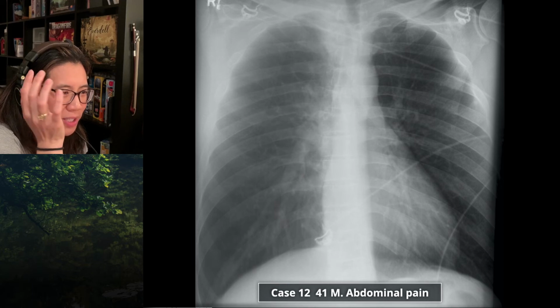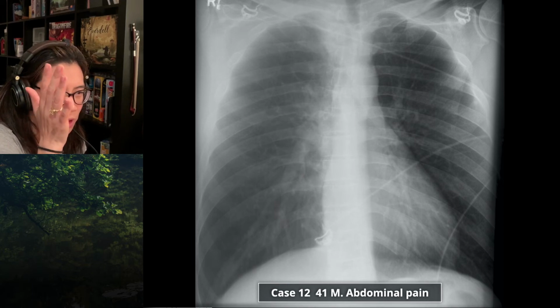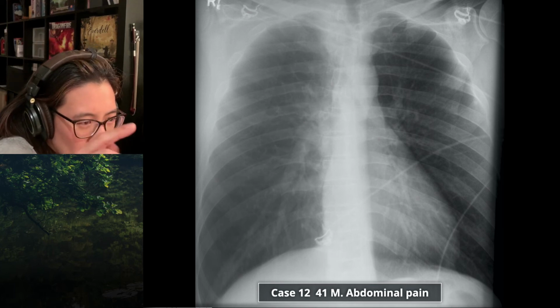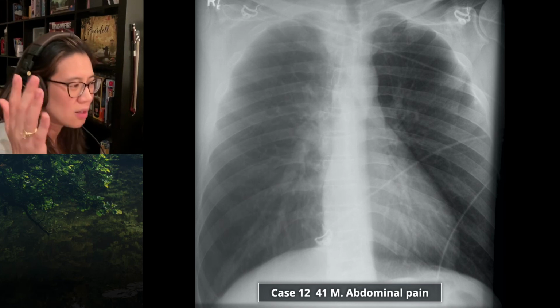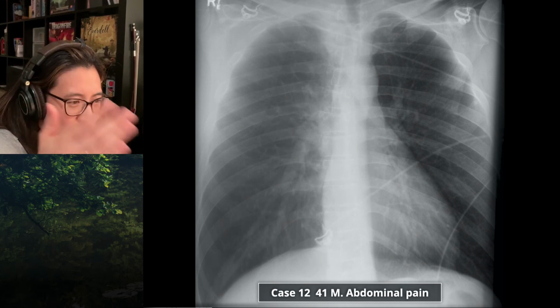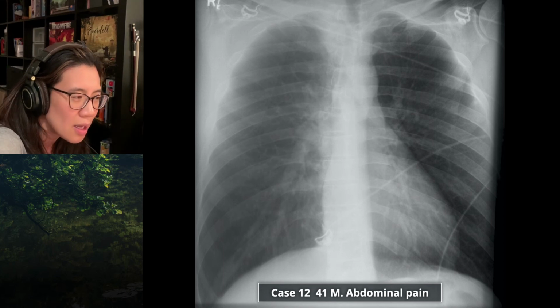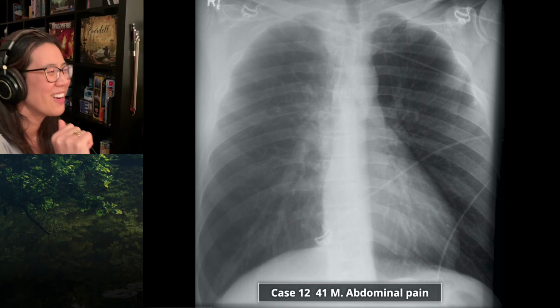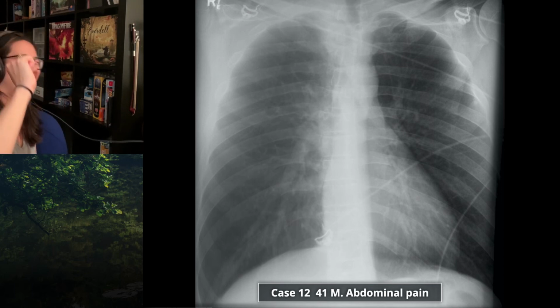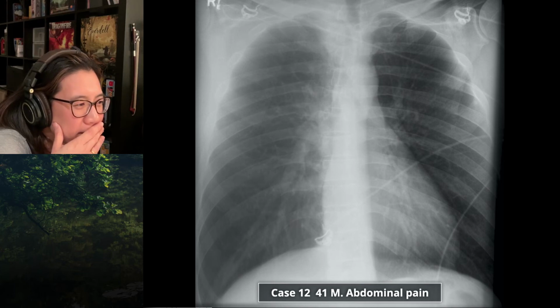I'm going to say non-technical things here, and I'm not sure if it's because it's the projection or what, but I'm wondering if this is a technical issue. The reason I say that is because on the left side I can see grid lines, and on the right I can't. Good. Ah, she got one right. Unbelievable. What are the other things you can see that make you think it's technical?